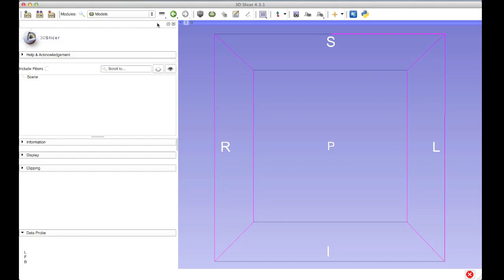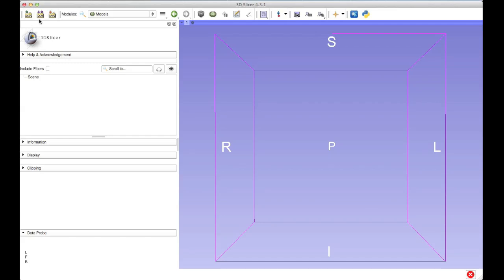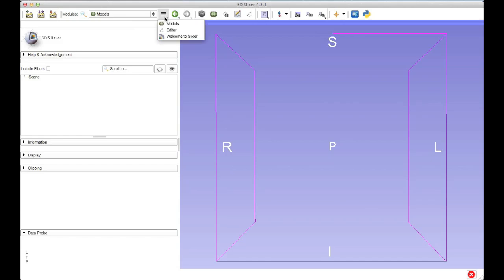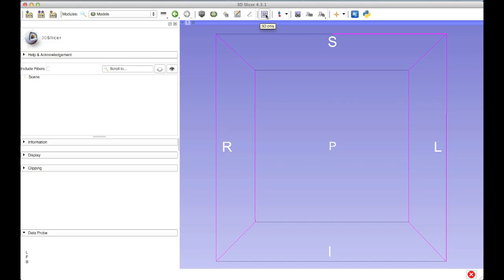I'm going to give you a quick orientation about the toolbar above. The first three icons are about loading and saving data — we'll be using the save icon at the end of this tutorial. After that are a series of icons that help you navigate between modules. You can use the magnifying glass to search for a specific module if you already know its name, then again is the dropdown list that allows you to access all the modules. This icon allows you to go between modules you've recently loaded, and these two buttons navigate back and forth between modules you've been using. After that are a series of core modules for easy access, and then the layout button to change the right-hand side of your user interface.